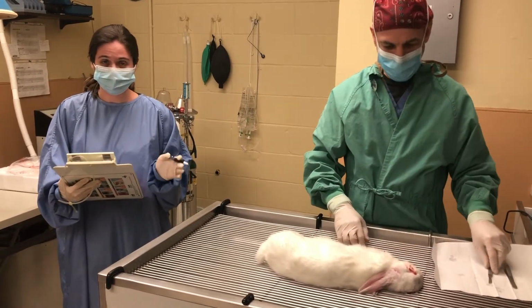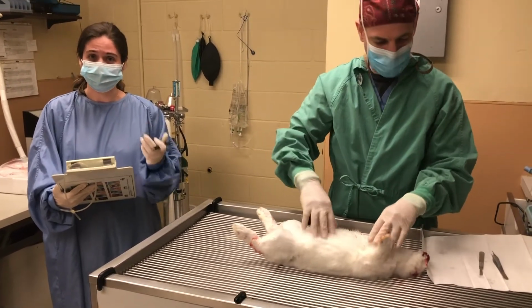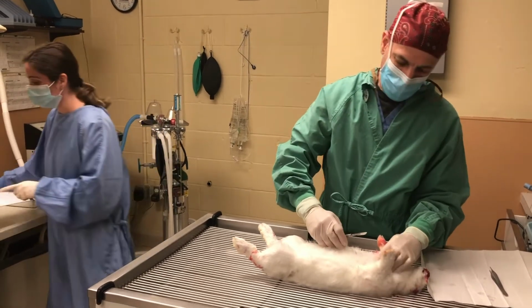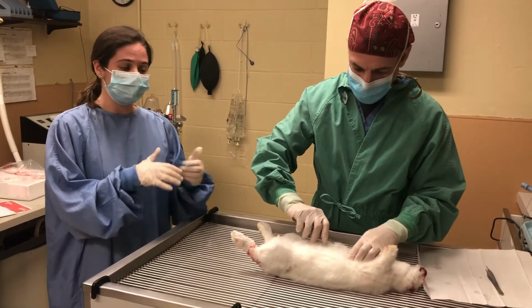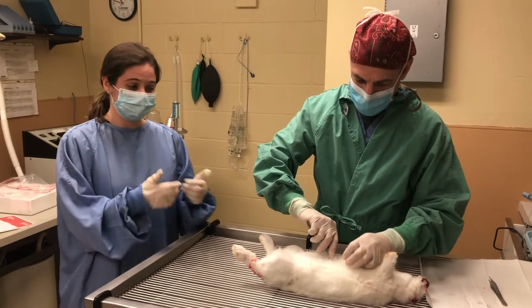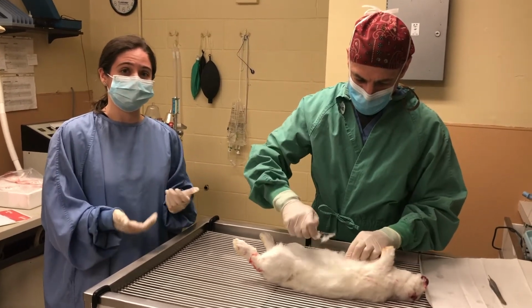And as his assistant, I'll be making any notes of anything that comes to mind, anything abnormal that he notes. I'm going to be writing down so that he can take a look at it later if he needs to. Okay. So now he's going to be making his ventral midline incision to open the body up. And then once the body is open, he's going to perform his internal examination, which, just like the external one, he's going to look at the organs, look to see if there's anything that could have contributed to the animal's death.